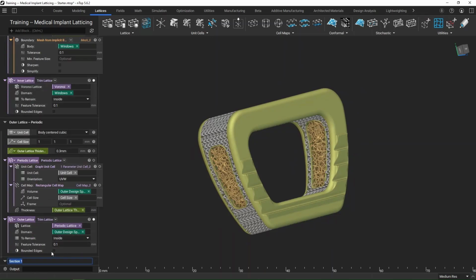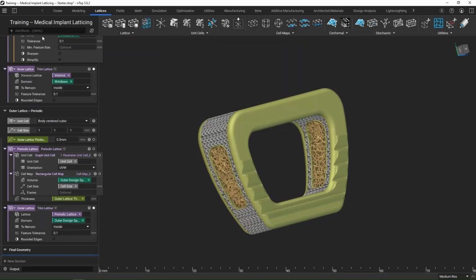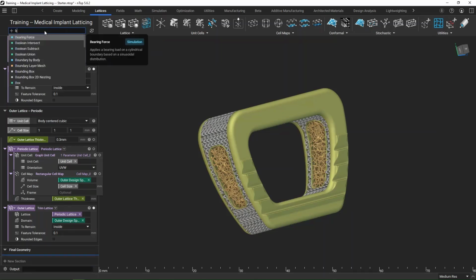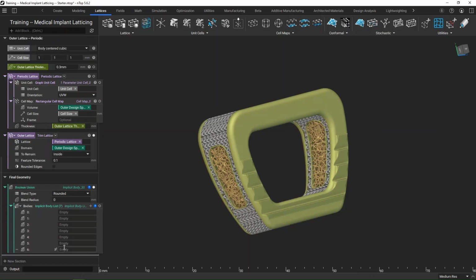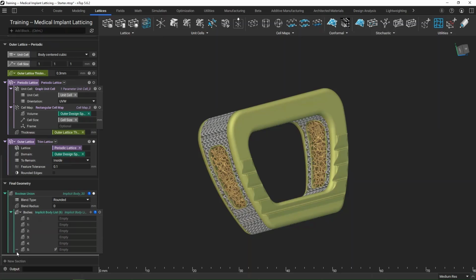So I'm going to go ahead and make a new section. This is going to be called our final geometry. And pretty simple. I'm just going to do one big Boolean union so that we can tie all 3 of our implicits together. You might have noticed I just clicked this plus button here. So I've got 3 different inputs. This implicit body list can be as long as we want. We can just union a whole bunch of things together at once. Very simple and quick operation in NTOP.